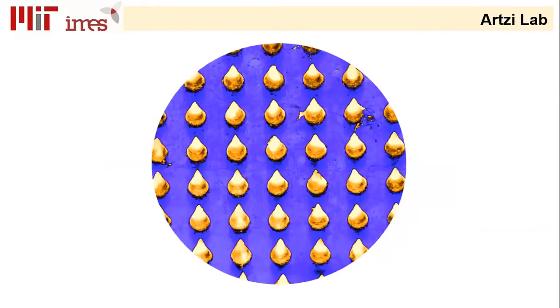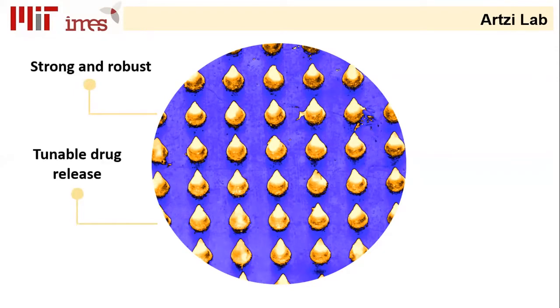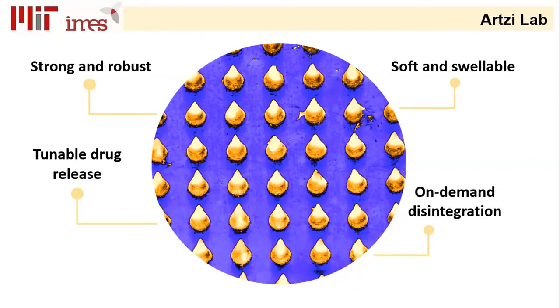So we took our winning picture during one of the first experiments of this project, when we were struggling to design a new and unique biomaterial that could be used to fabricate the microneedles. For us, this was the challenge of the project, because the microneedles had to be strong enough to penetrate the skin and release the therapy, but at the same time, they had to provide this nice and cozy place for cells to flow inside. To meet this diagnostic goal, we had to design microneedles that could be entirely disintegrated, but only after retrieving them from the patient. Once out of the body, we would dissolve them and analyze their contents.